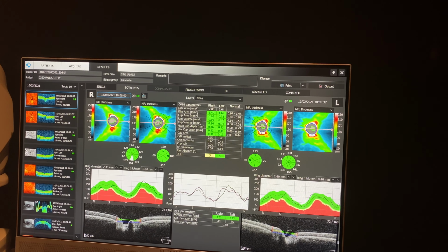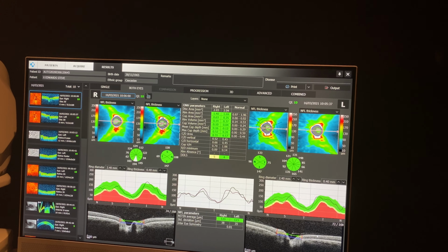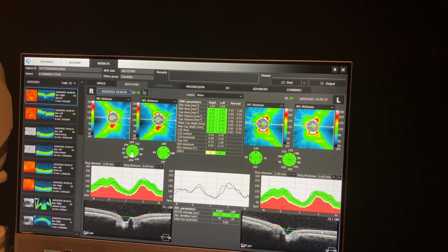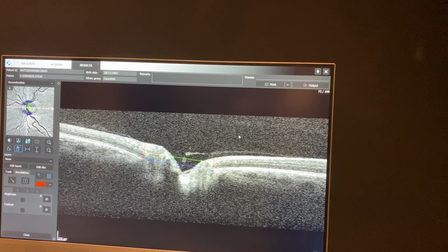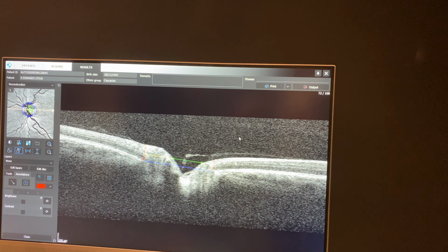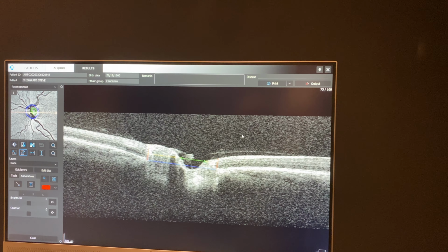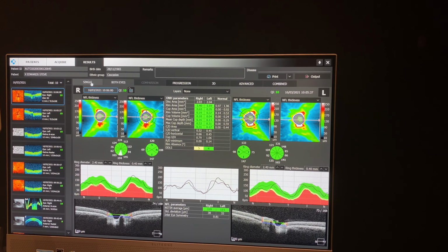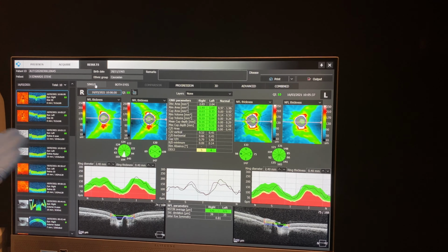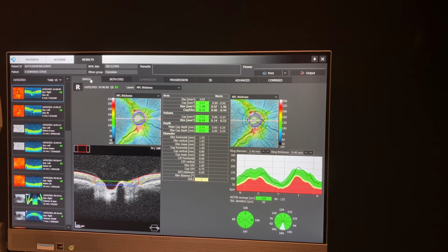I've actually got an interesting left, well, some people would say it's not interesting, but I've got lots of vitreous hanging off on my left disc. So if we double click the left tomogram, you start to see it, and if I slowly roll through it, you see lots of bits hanging on. But I don't have any vision there, so nothing to worry about. So that's a disc right and left. We go back to single eye view.